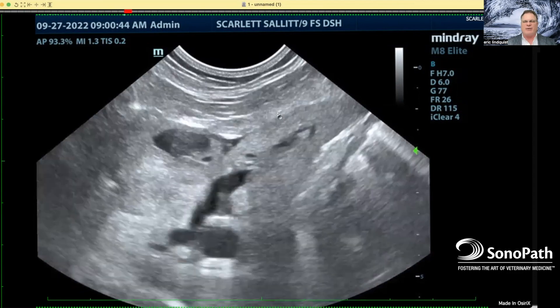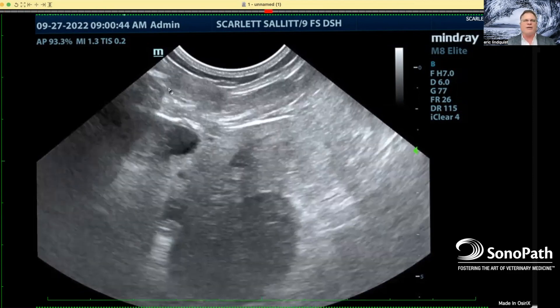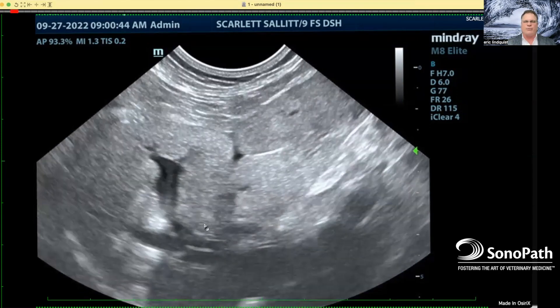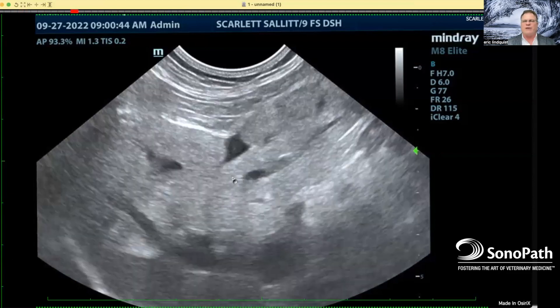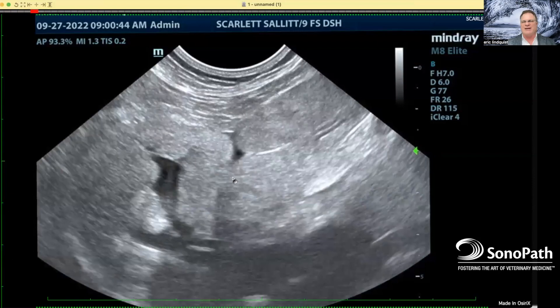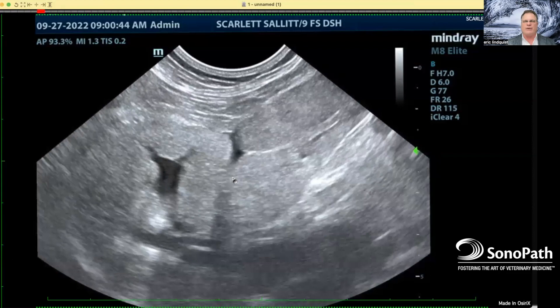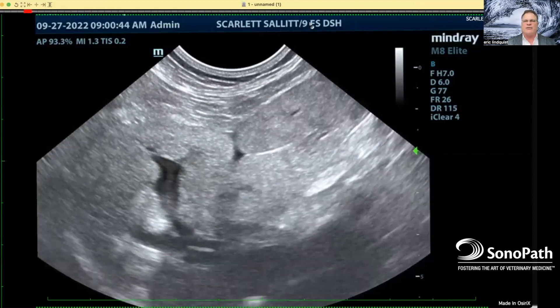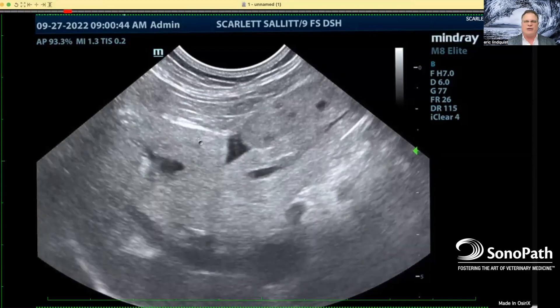In this case the bilirubin is off the roof, and I wanted to show you how to decipher through these sort of cases. This is a liver — the depth is a little short — but you can see the heterogeneous changes throughout the liver. Cats don't typically do nodules well in their liver, whereas dogs can get nodular hyperplasia all the time. Cats have to live to be pretty old to get nodular hyperplasia, and they have benign changes in my experience. This is a nine-year-old cat and you can see these heterogeneous nodular changes.